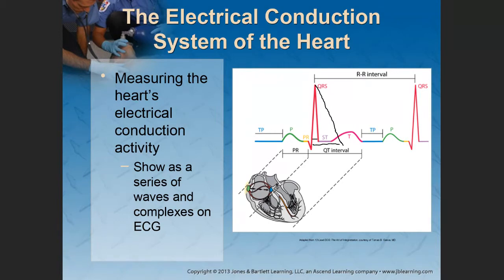Yes, sir. Thank you. All right. Are there any other questions? Yes, Mr. Jones, go ahead. I was just making some notes. Can you state again what the RR interval signifies, please? That's the distance between two beats. So the RR interval is the distance between your beats, and that's the distance that we will use to determine the heart rate.